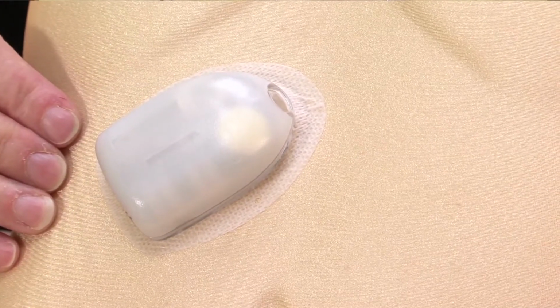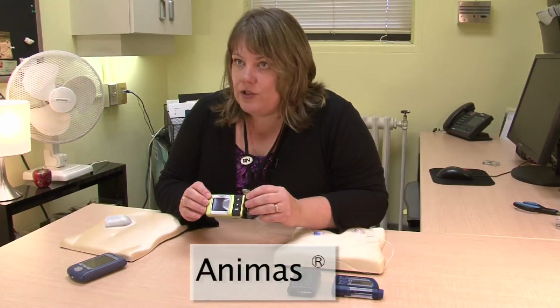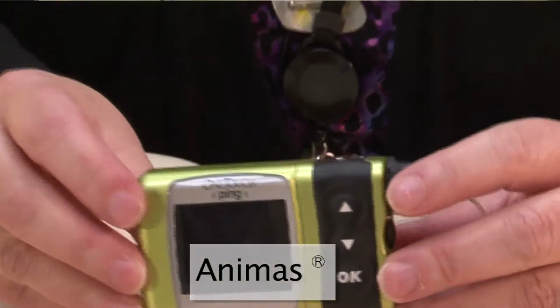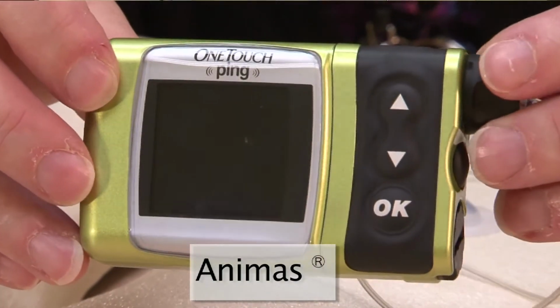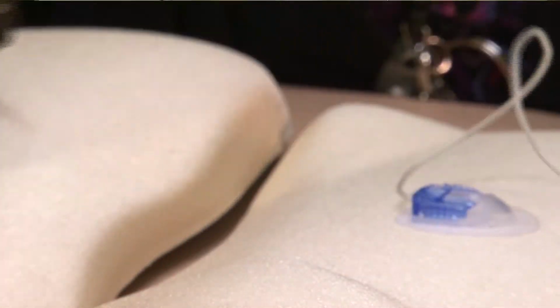Okay? Another pump that's out there, this is the Animas pump. This one is green, but it can be many different colors. It can be blue, pink, black, silver. So this is a tubing pump, connects up to the same thing. All pumps would be worn in the same place. They would be in your abdomen, your arms, your legs, your back, your hips. This one has a tubing.